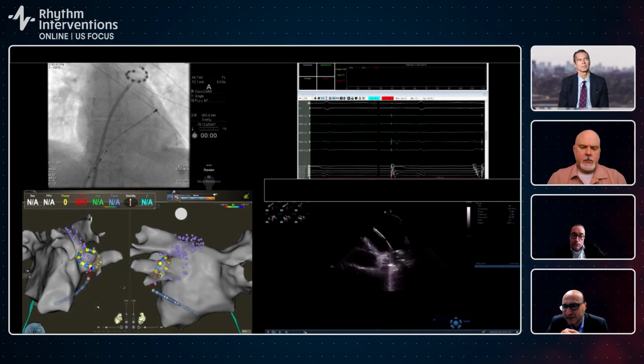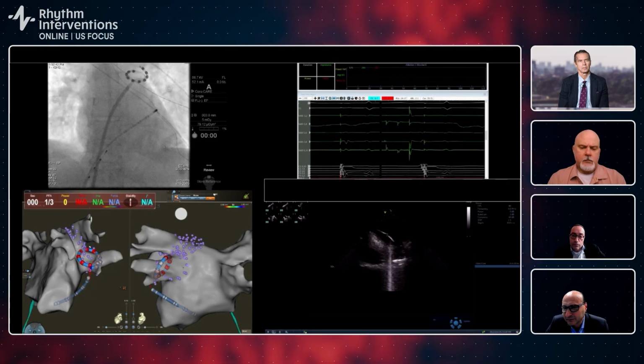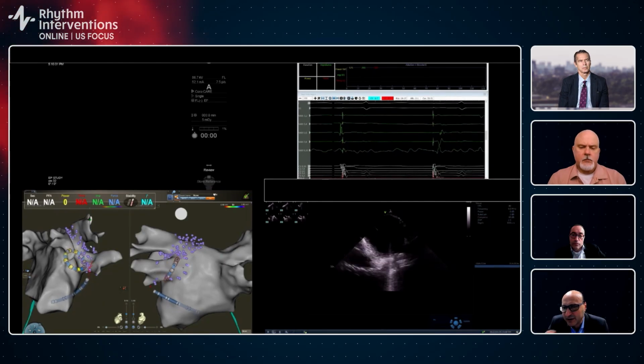So you can eliminate from, so it's 1 to 10. You can eliminate either from 10 to 7 or 1 to 4. Or you can eliminate electrode 1 and 10, which is the distal more electrode. So the electrodes that you can eliminate should be consecutive.